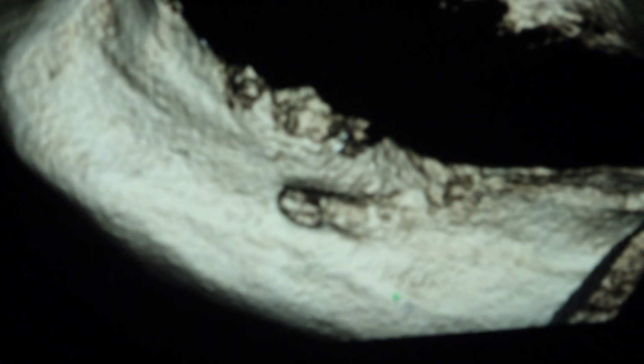You can see, no? The mental foramen travels till here, up to the crest. So when we are opening the flap, we should be careful not to damage the nerve. Can you see the depression? This channel is going till the crest. Okay, this is a variation.